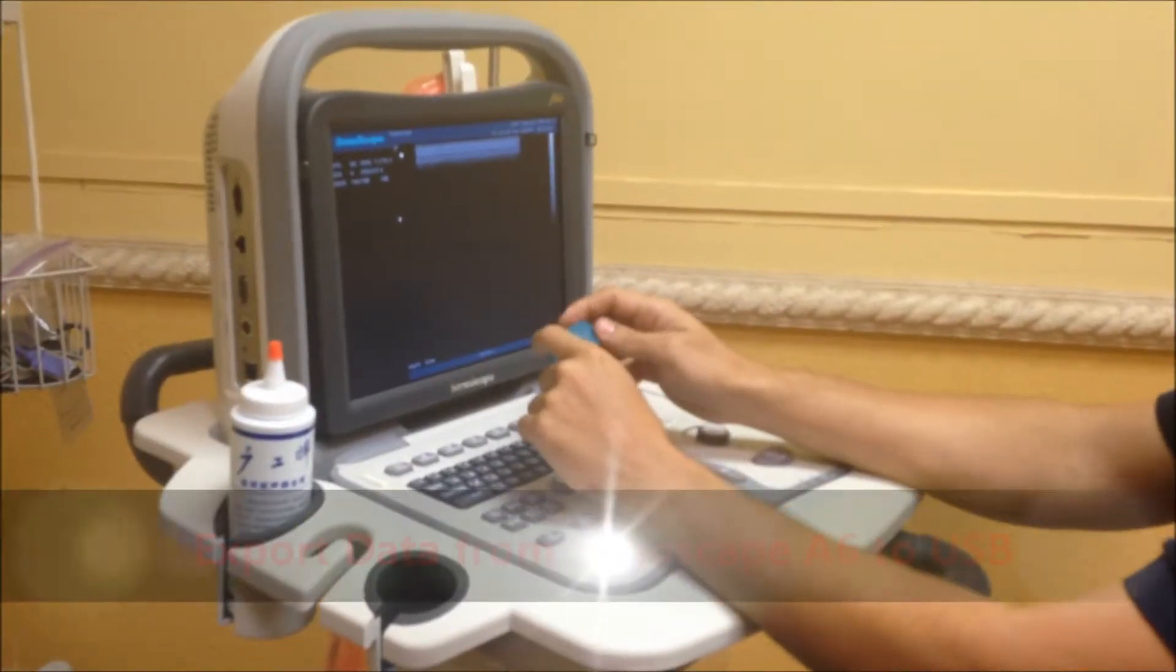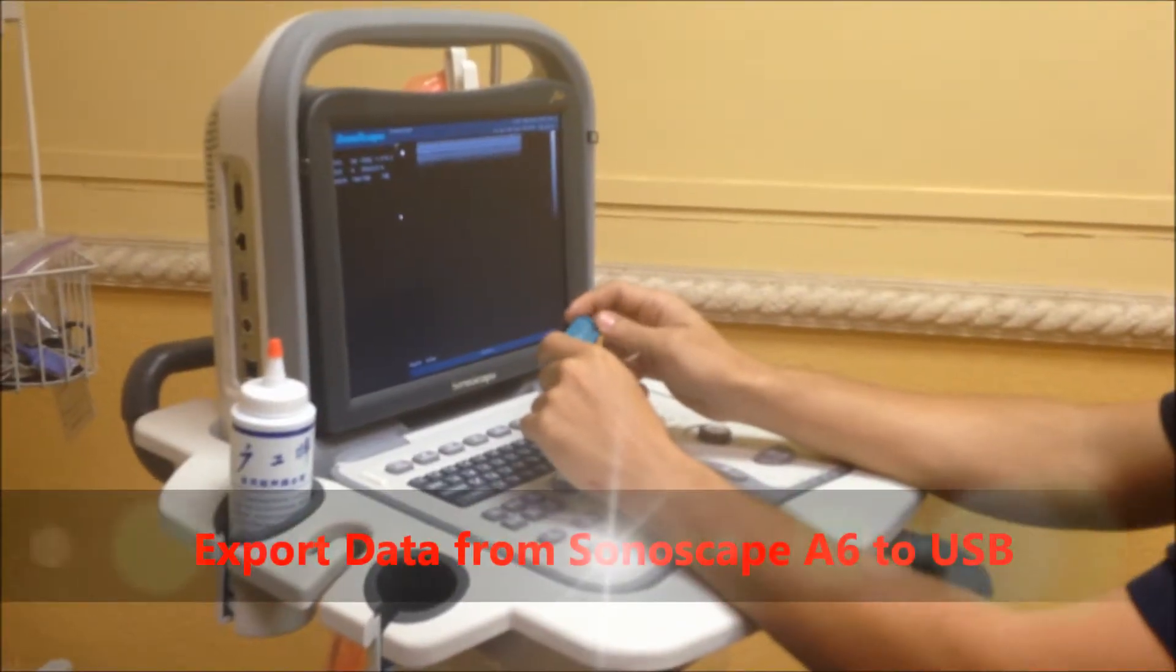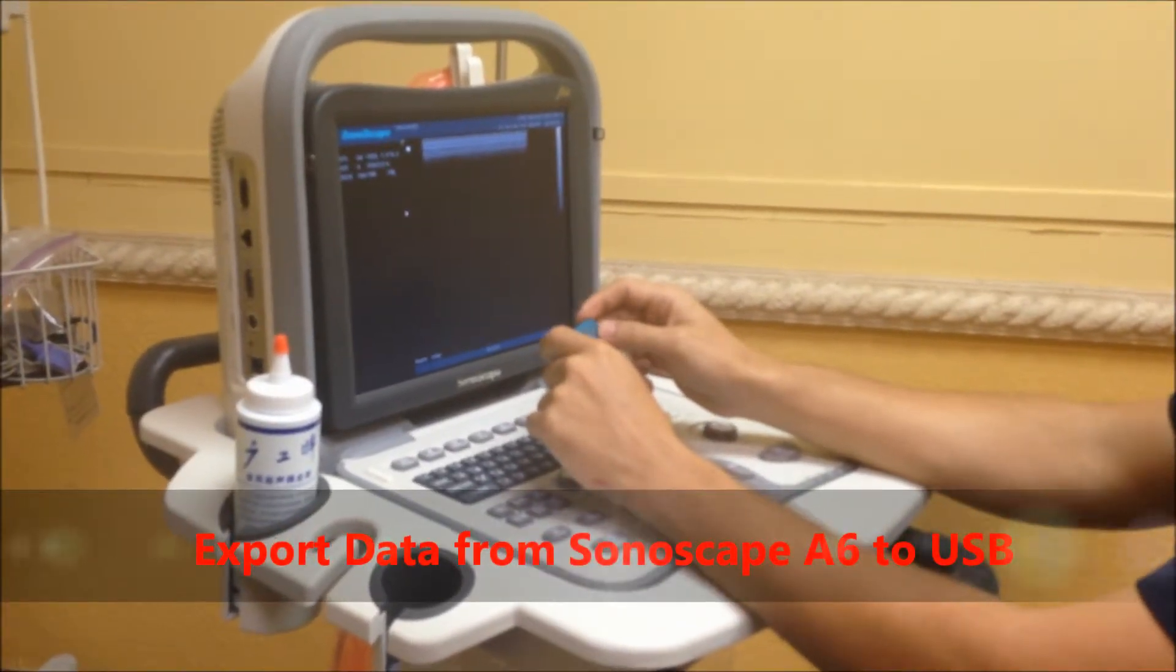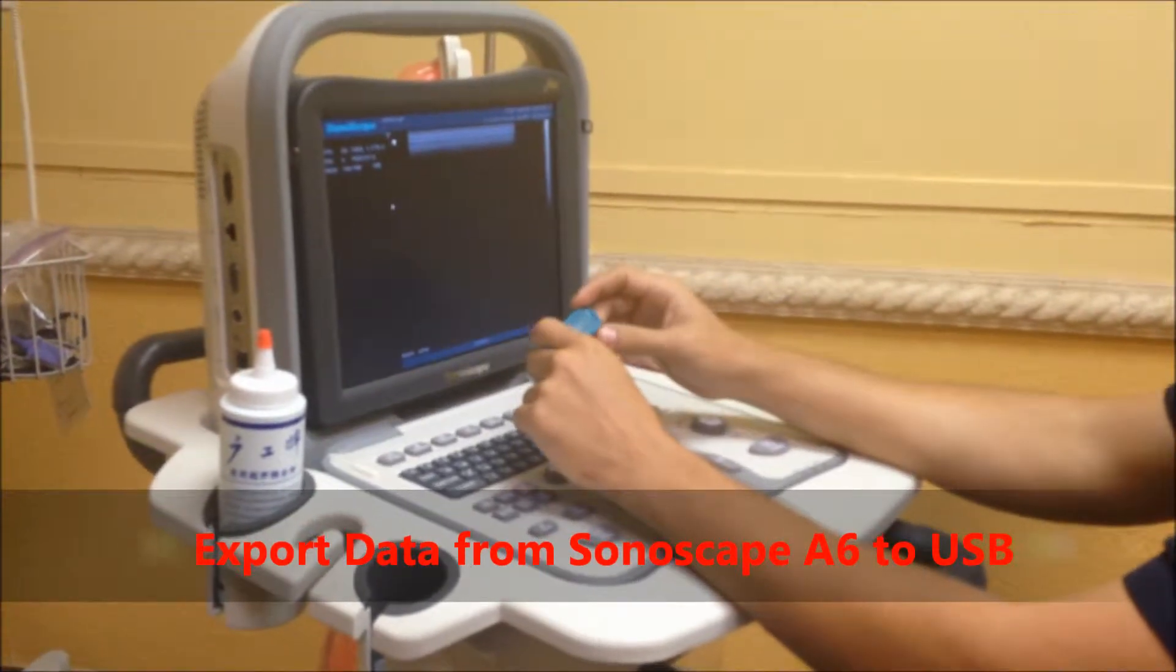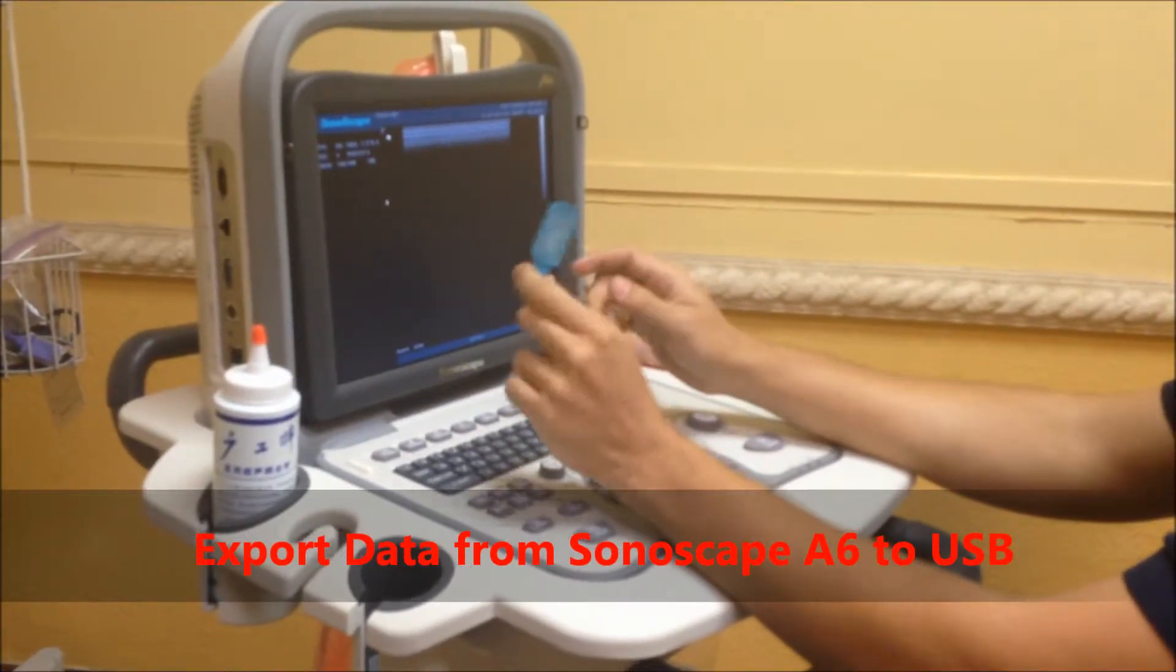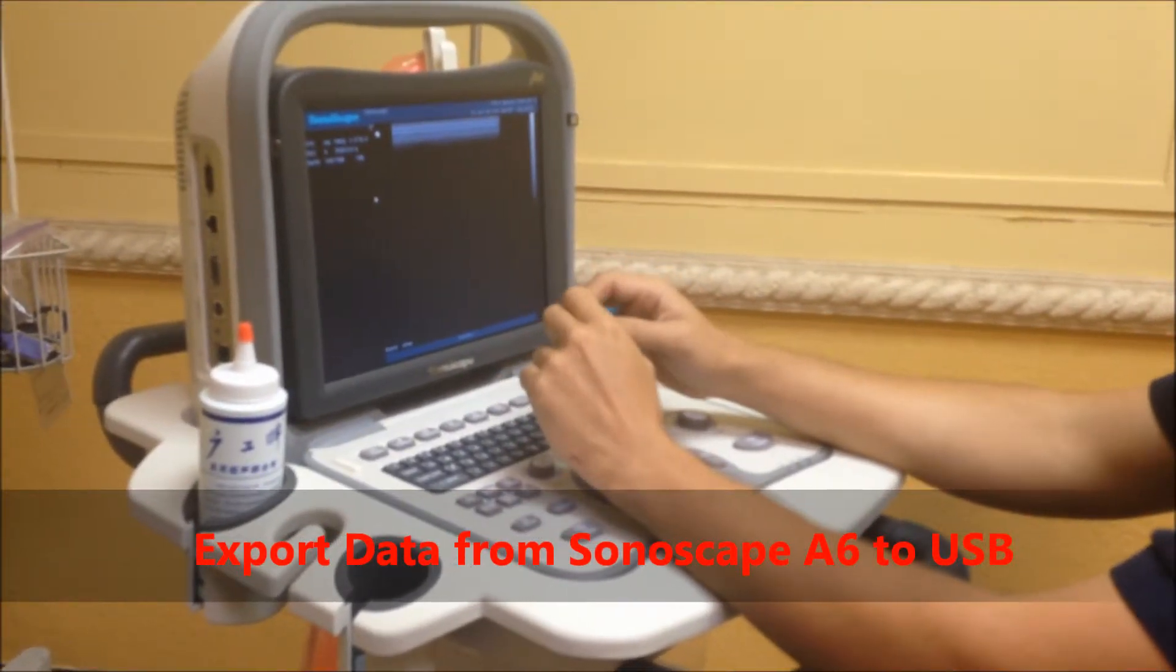Hi, I'm George from Doctor's Toy Store and today I'm going to show you how to export from the Sonoscape A6 to a USB.